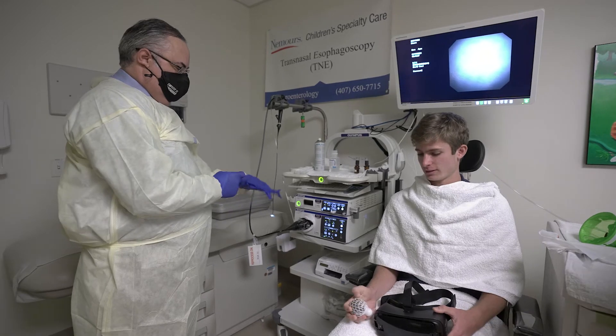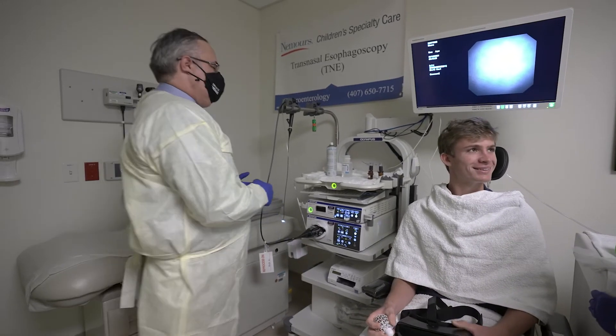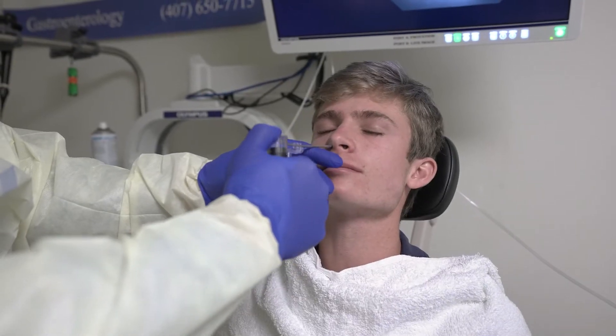Transnasal esophagoscopy, or TNE for short, is an exciting new technology where children can have a camera study or endoscopy done without anesthesia or an IV placement. This is done in clinic with some numbing medication of the nose and throat.